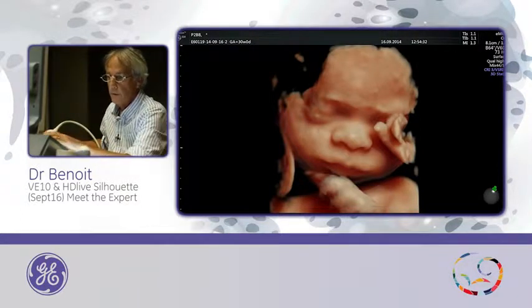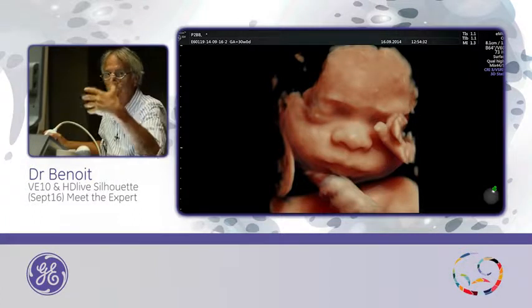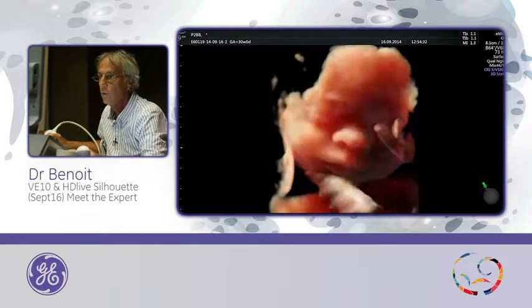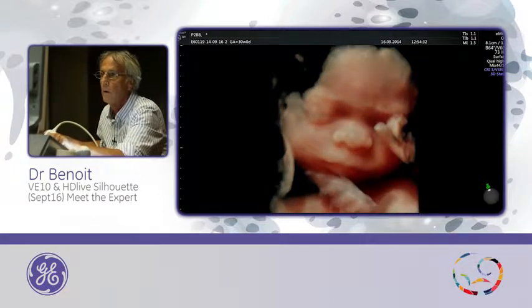This is a result. It's nice. I save it. And this is a HD Life, and on the sub-menu you will see there is no silhouette on this one. This is a classic HD Life. You can move the position of the light. And now I will increase the silhouette, and you will see the result.